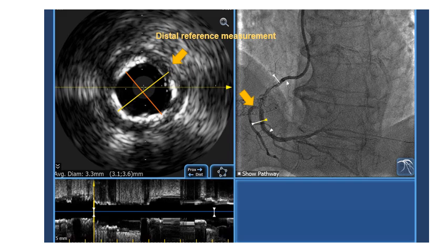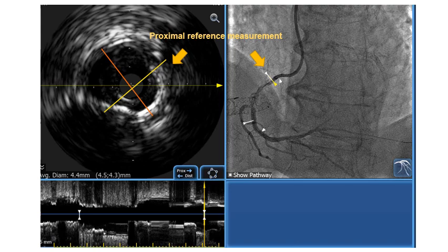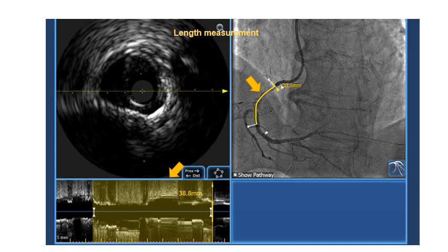These are the images generated by the system after co-registration, from which we decide the distal reference measurement where we will land the stent. Our distal reference measurements were 3.1 and 3.6 millimeters, and our proximal reference measurements were approximately 4.5 and 4.3 millimeters. The system automatically measures the length between distal and proximal reference points, which was 38.8 millimeters.